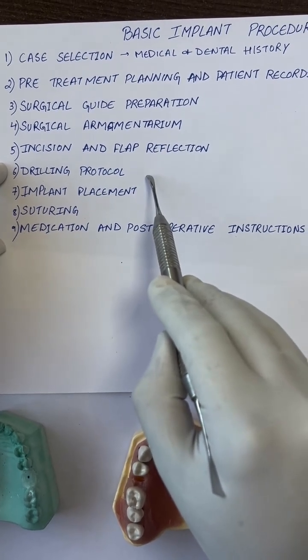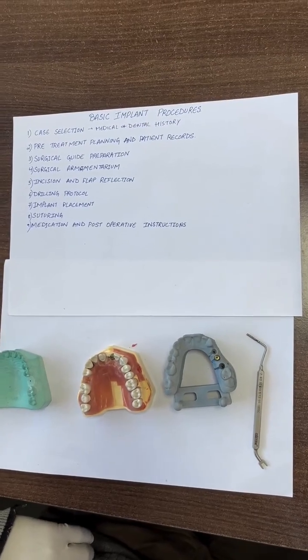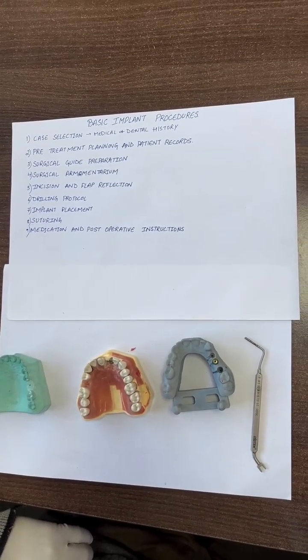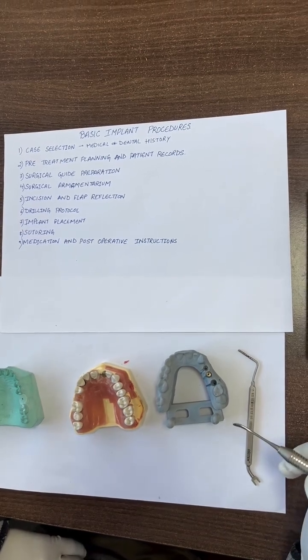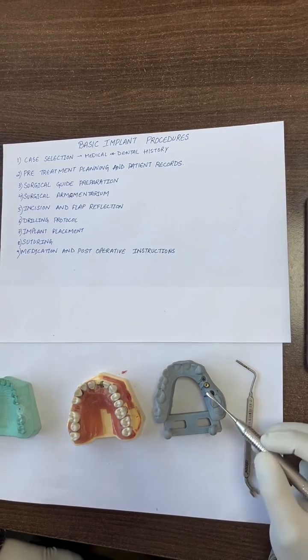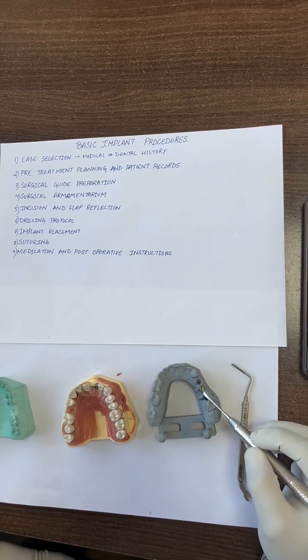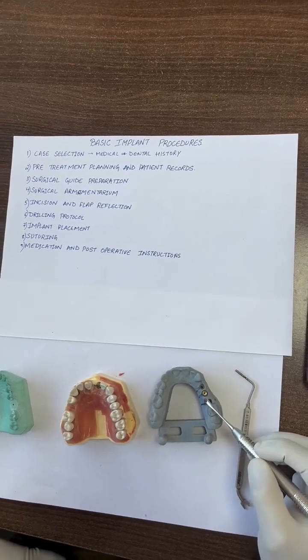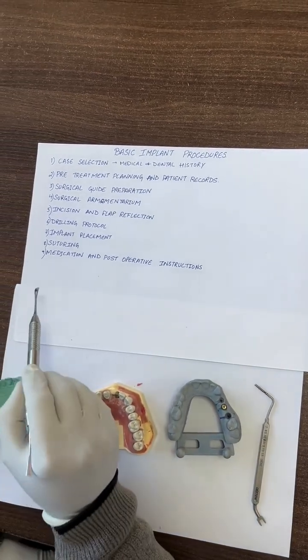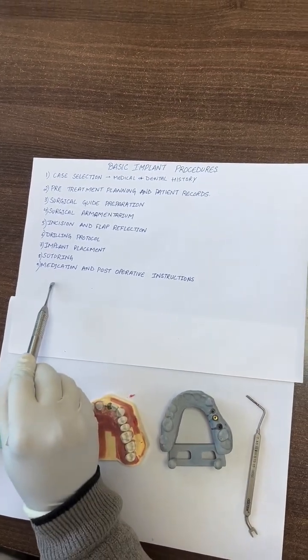Once the osteotomy is made, we are ready to place the implant as per the manufacturer's instructions for the RPM as well as for the torque. So after the implant placement, we can cover the implant either with a cover screw or with the healing abutment and do the suturing. The patient is discharged after giving the post-operative instructions and the necessary medications. Thank you.